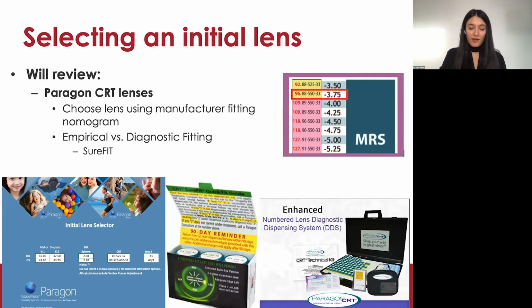Part of the reason why I like this lens is, again, the parameters are mostly intuitive and straightforward, and there's not a lot of choosing to do. There are about three or four things that you can change, and that's it. It helps to keep things simple and achieve better fitting results sooner.